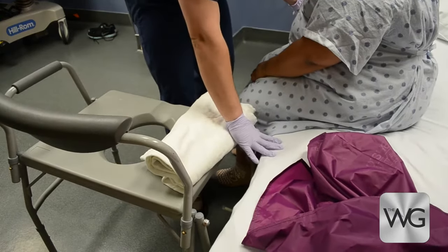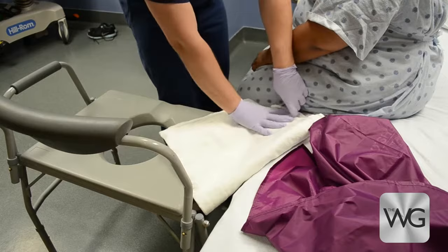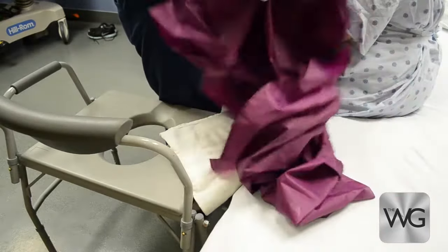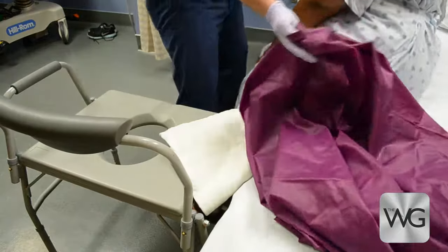If a gap exists between the commode and bed, bridge the gap using folded bed linen or a pillow. Take a single slide sheet, fold it in half, instruct the patient to lean toward the side away from the commode, and tuck the slide sheet under the patient's bottom and thigh. Ensure the patient is able to place her hand on the mattress surface, not on the slide sheet.